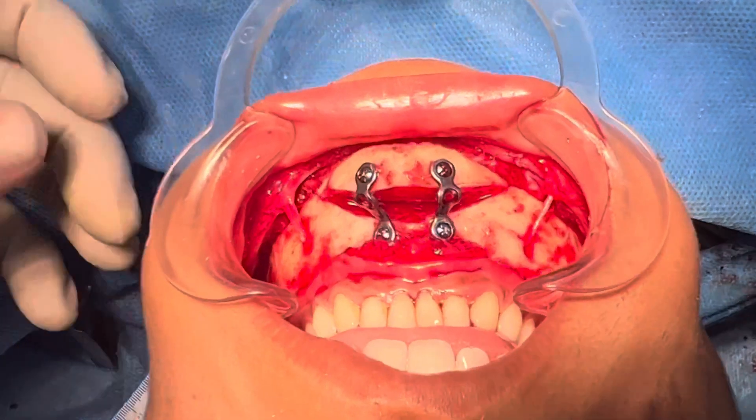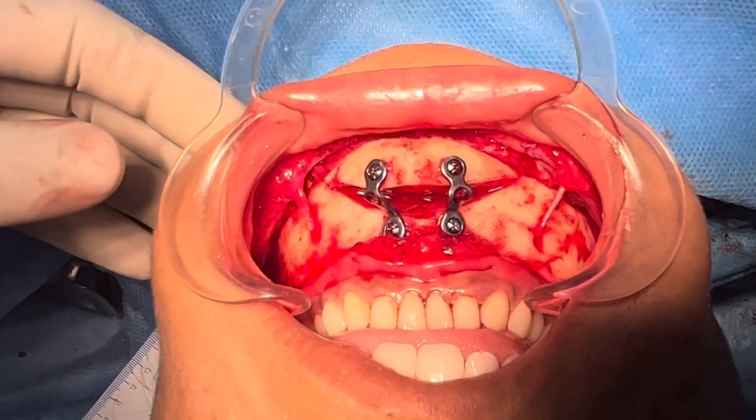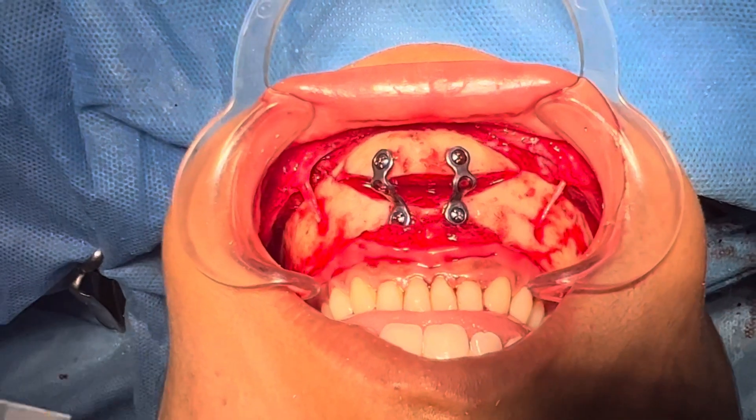We've also done bilateral angle osteoplasty, along with a lot of work on the body as well, in order to give the patient a slimmer profile.